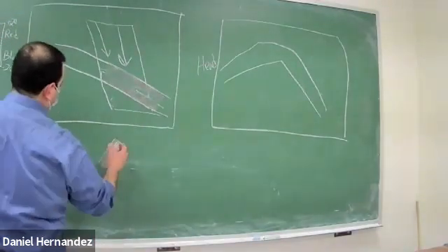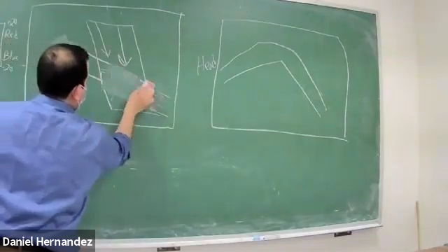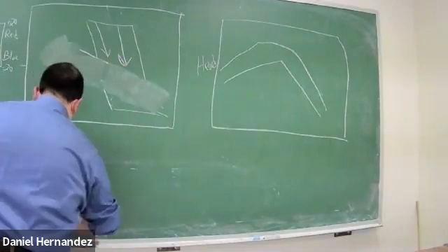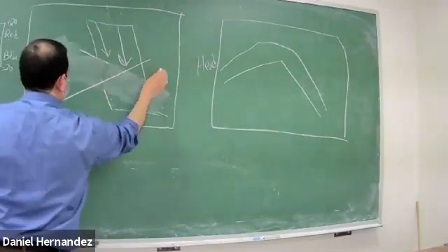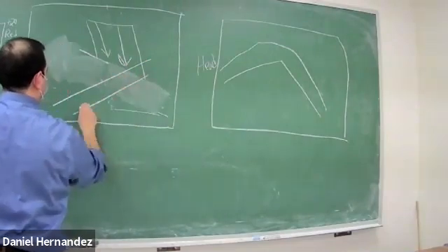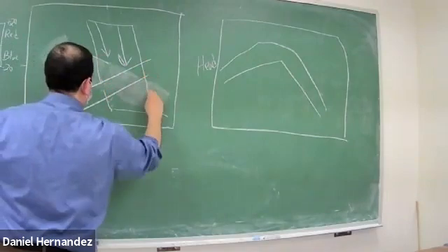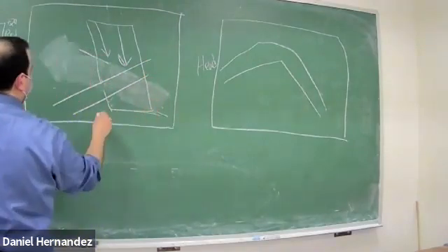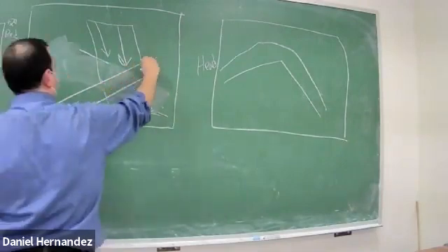If I kept my color box in that same position, I get a vessel running the other direction. So blood flow is still going up towards our head.